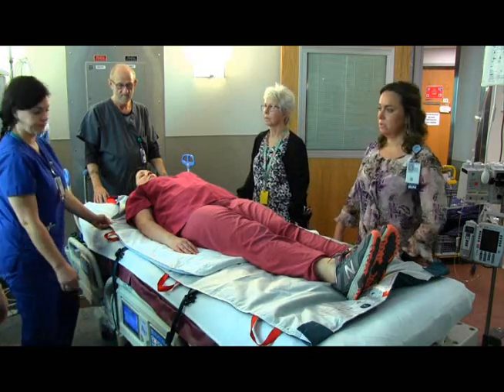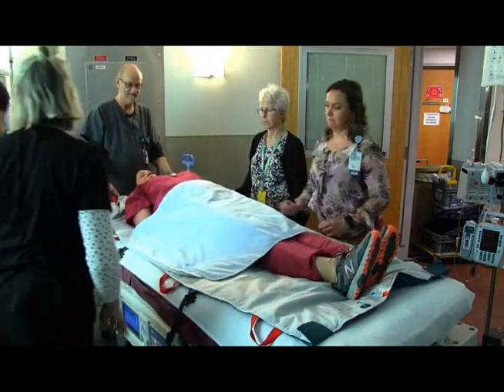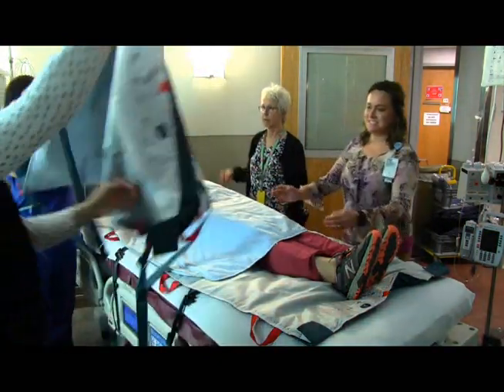Max inflate the air mattress. Place the air-assisted mat and pad beneath the patient. Then place a second air-assisted mat and pads on top of the patient.